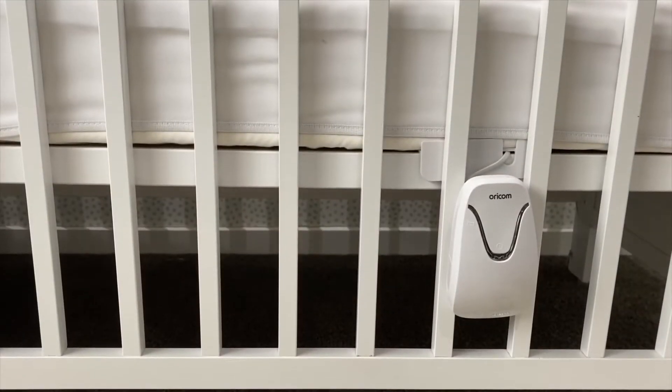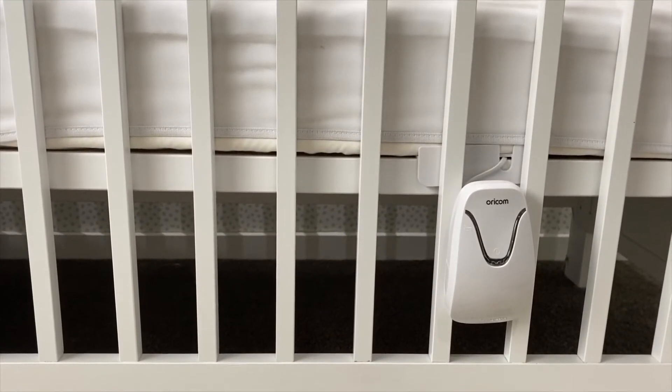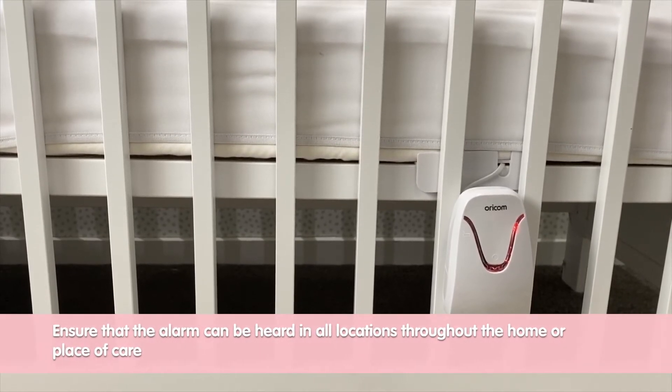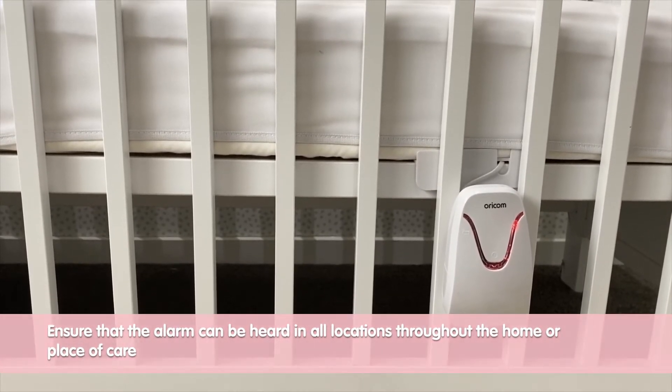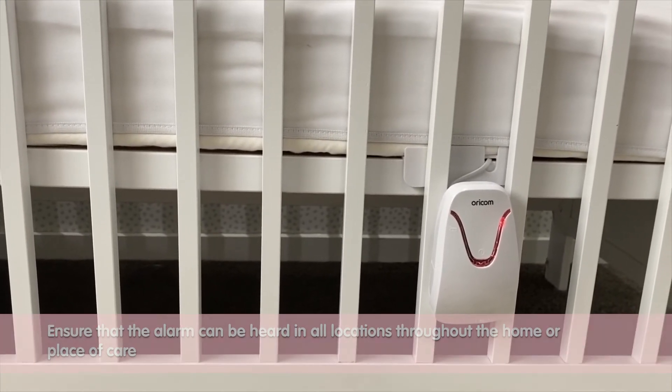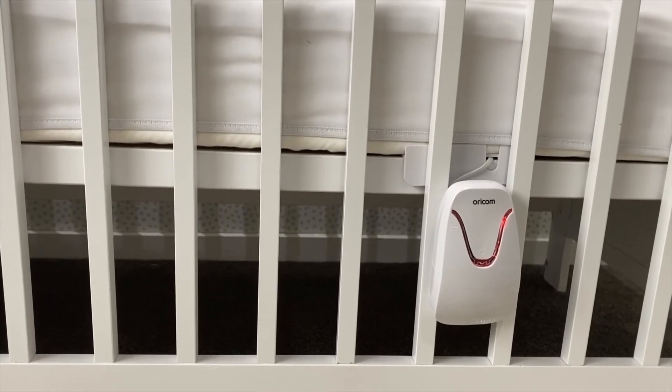In the event that a baby's breathing movement rate stops or slows significantly, this audible and visual red alarm will activate. As you can hear, it is a similar noise level to that of a smoke alarm, so it is sure to wake up even the deepest of sleepers.